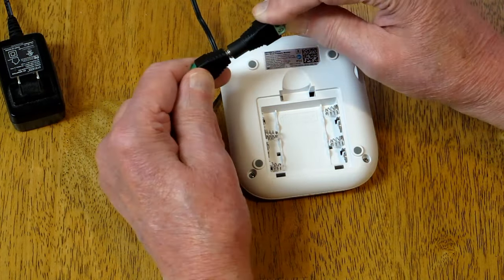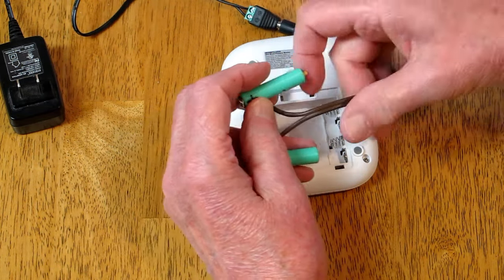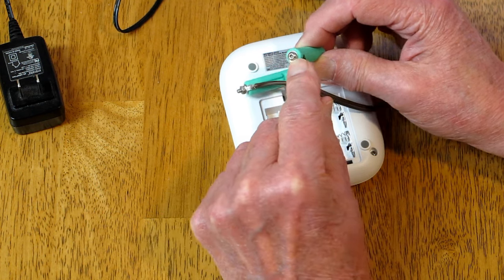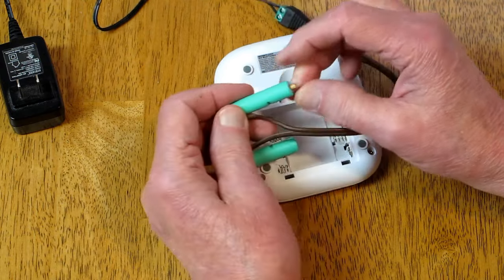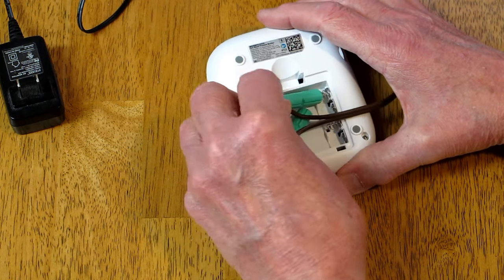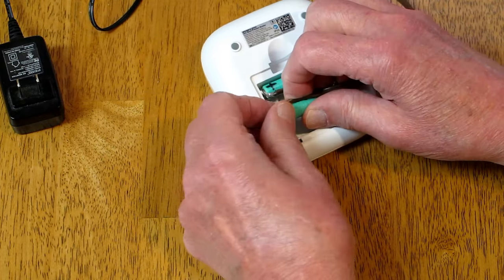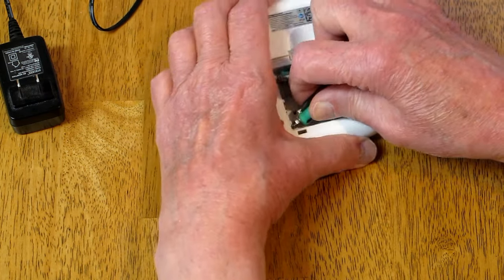On Thingiverse I found these little fake batteries already designed to replace a AAA battery. It's an M3 button head bolt that I put in here, soldered a wire to the connector, and then I put a little piece of bamboo on one end — that goes inside the spring to keep it in place. On the other end, I cut the head off an M3 bolt and screwed it in, and that will go inside the spring on that side.